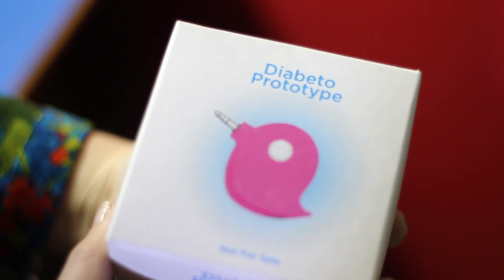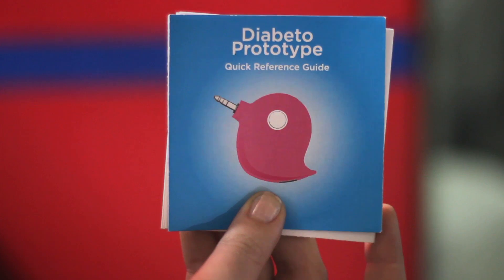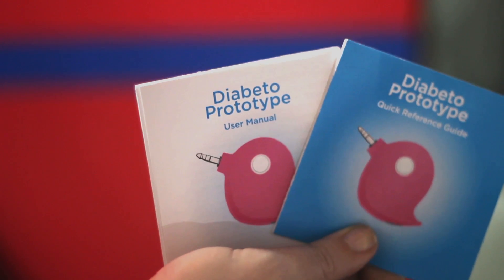So let's check out a quick few things before we begin. To set up your Diabeto, you're going to need your quick start guide and the user manual.